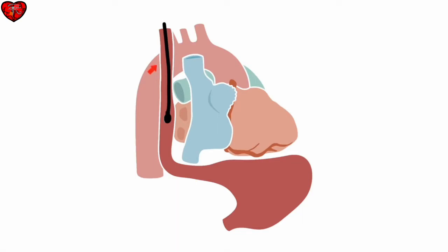In order to visualise the descending thoracic aorta beyond the arch, we need to turn the TEE probe physically through 180 degrees so that it's pointing posteriorly. It's very important when we do so to make sure that the probe is straight — in other words, that there's no flexion at the tip — as this can be very uncomfortable for the patient and runs the risk of causing trauma to the oesophagus. Once we've turned the probe, we can then advance and withdraw it as necessary to image the whole length of the descending thoracic aorta, right down to the level of the diaphragm.